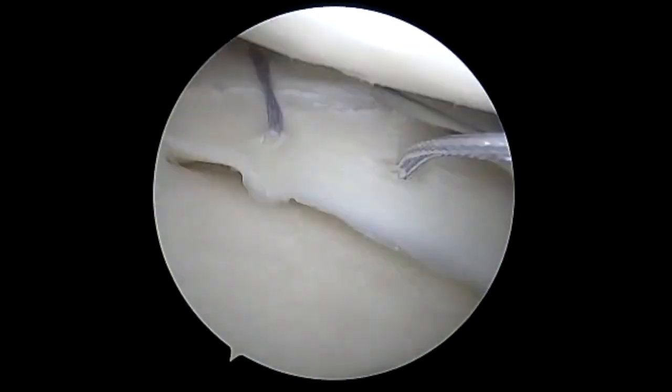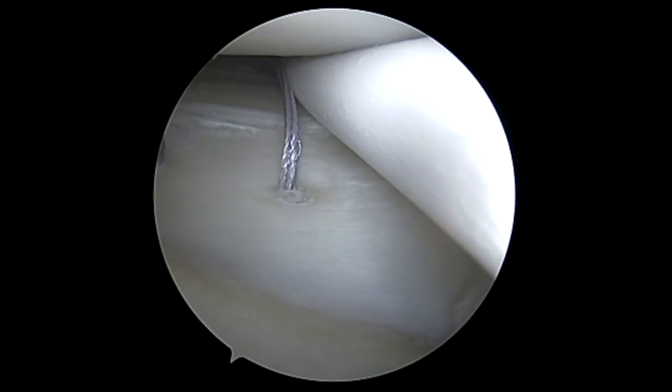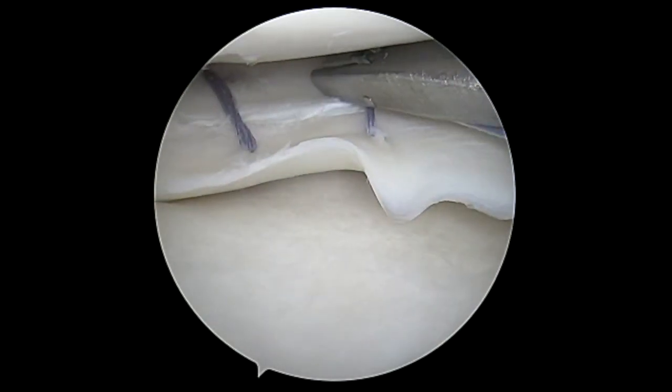Again, you can see a very small, low trauma puncture. We're going to do it above the capsule, and we're able to get back there easily with this smaller needle. We've tensioned it and now we're going to cut it, and you can see we've compressed the meniscus repair.